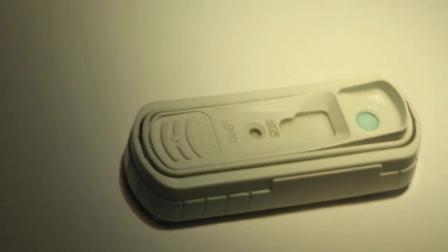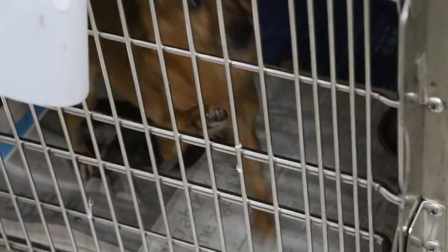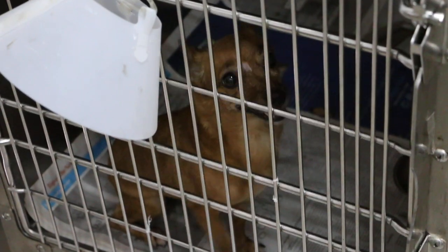This is the patient whose blood we took. Switch on the lights. This is a six-year-old female dog. Today is the ninth day here already.